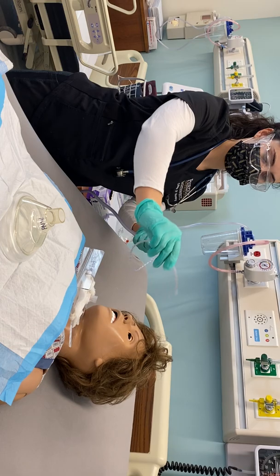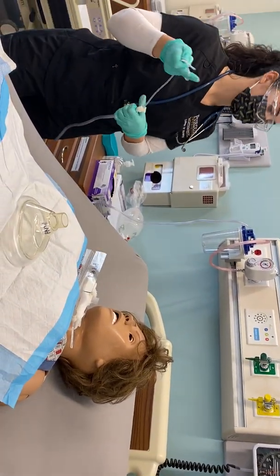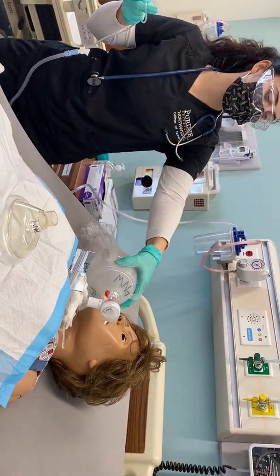All right. Okay, now I'm just going to ambu you, Mr. Jackson. Some more deep breaths.